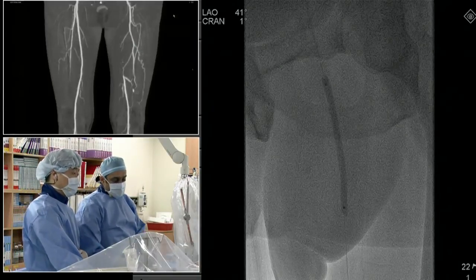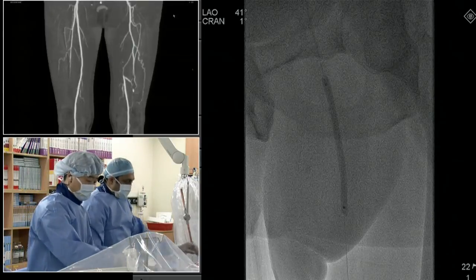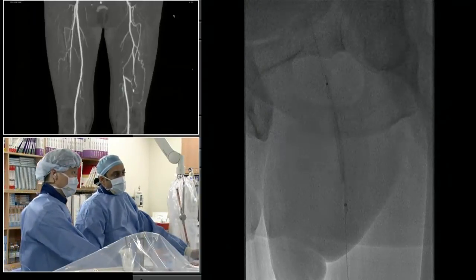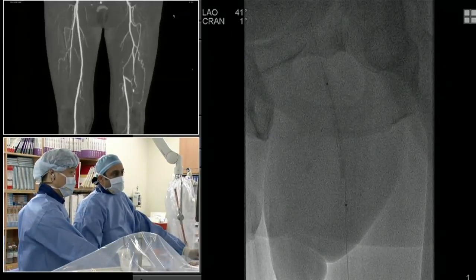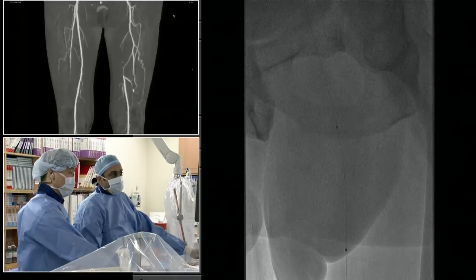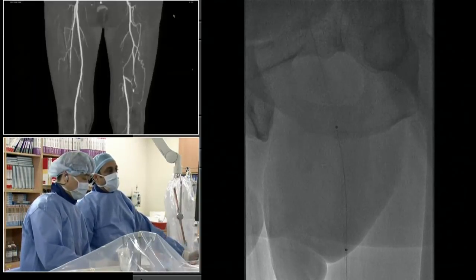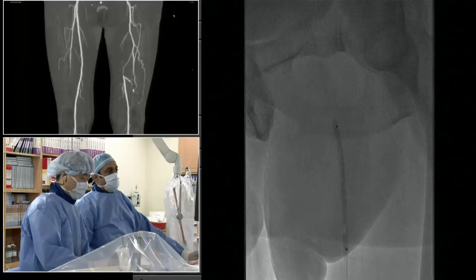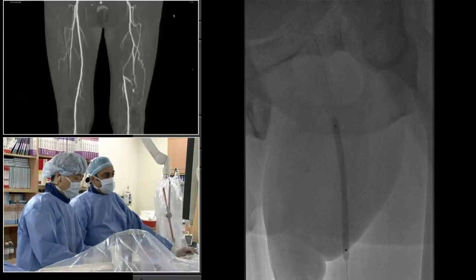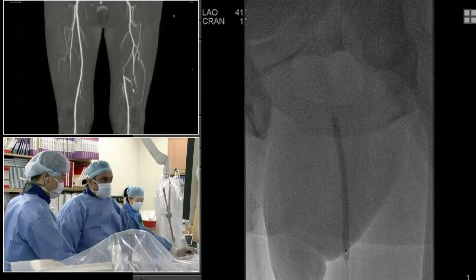And back to your original question about pretreatment, IMPACT certainly had a pretreatment strategy, had to predilate to get the drug in there. Here with atherectomy, you probably expose the target of your therapy, which is the media, so that the packets of paclitaxel are actually deployed in the place you want them. But it seems like a sexy approach here. I just don't know, to your point, if it's very cost prohibitive unless there's a cost-benefit analysis that shows it later to be beneficial.